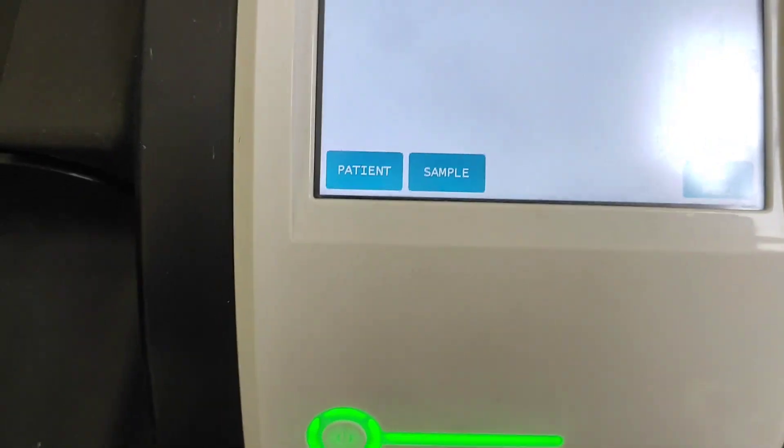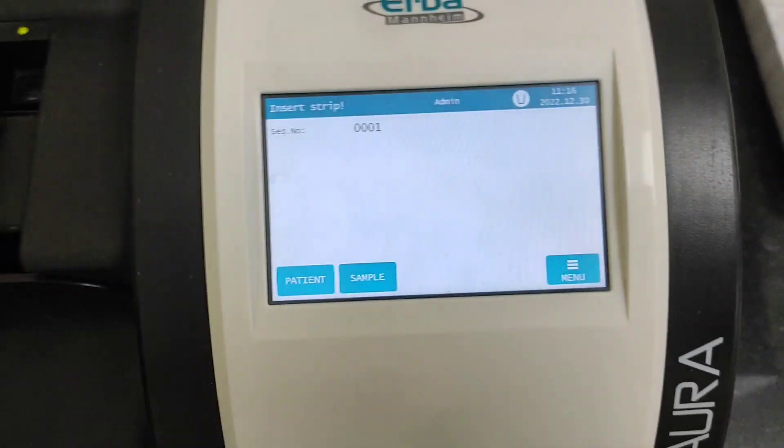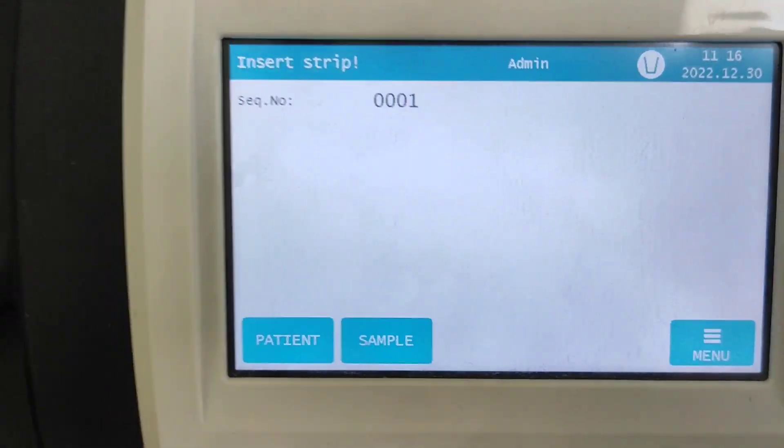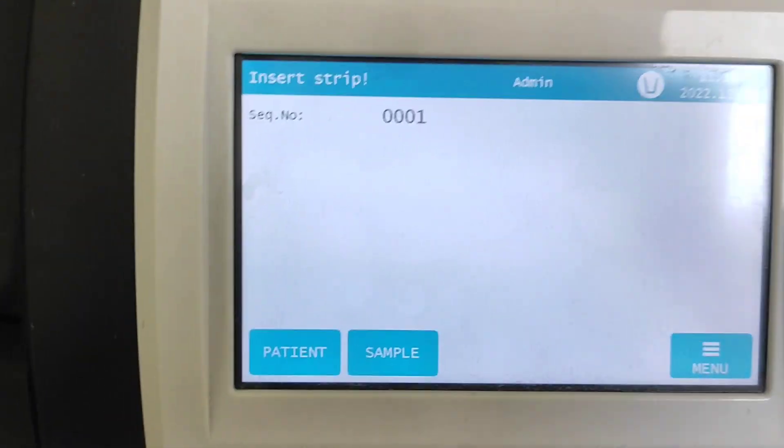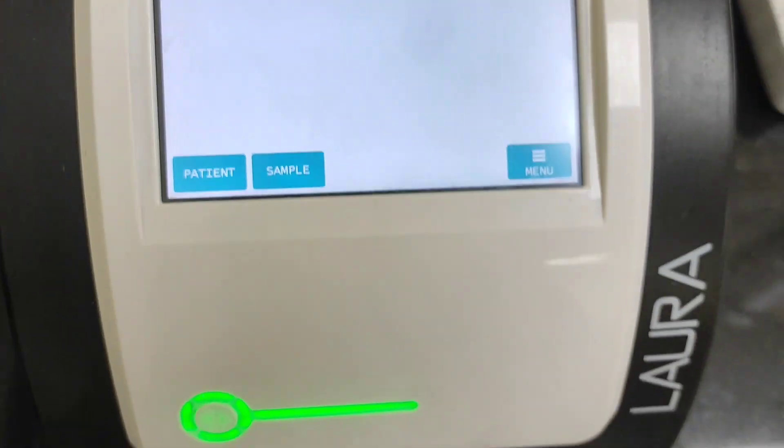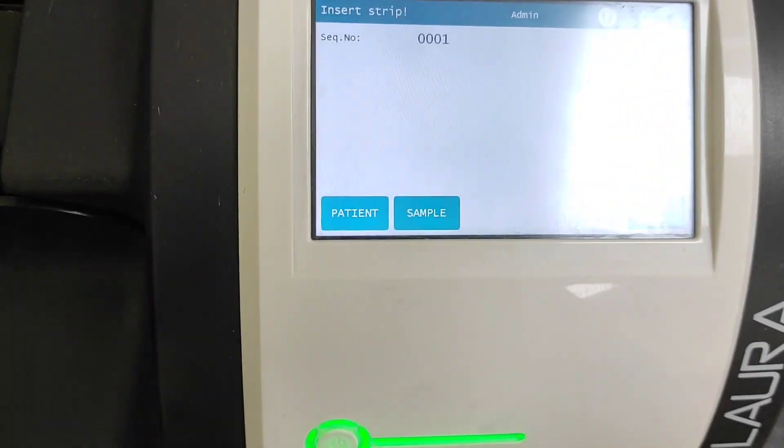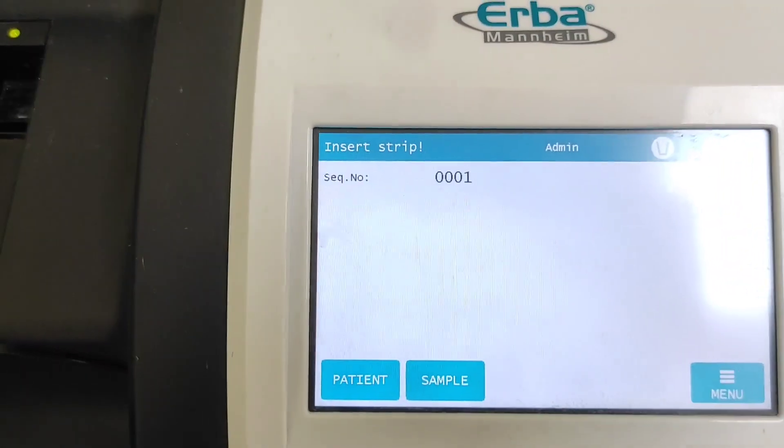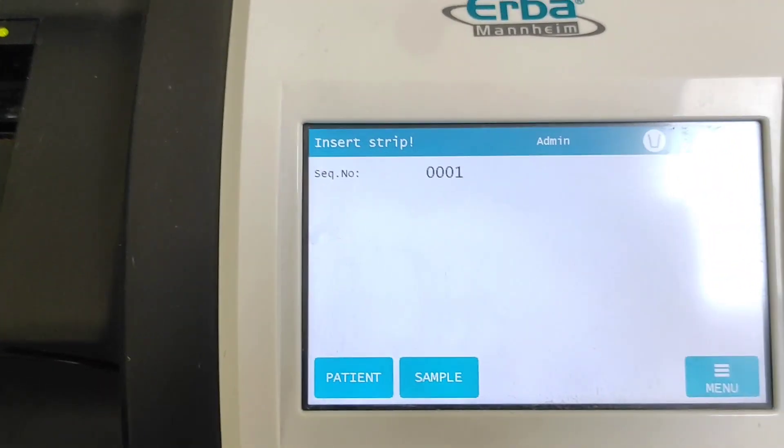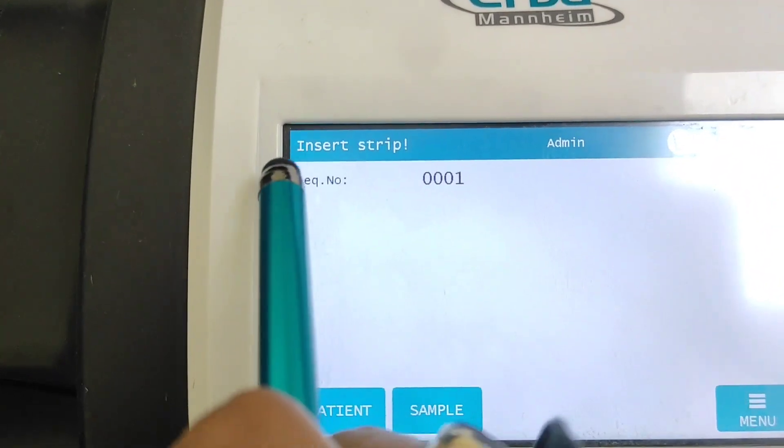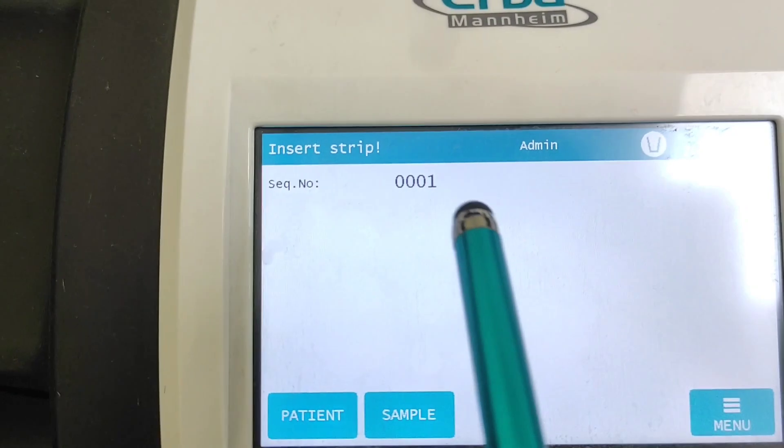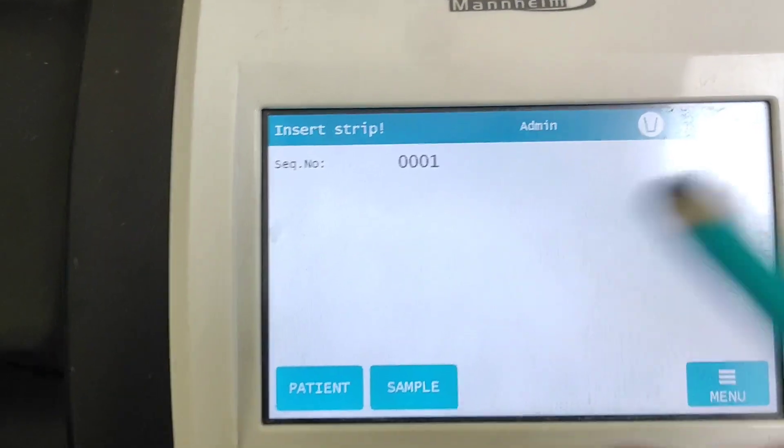So yeah that's it. And as you can see, if you are running the sample in the sequence, as you can see here is the sequence number 0001, it will just automatically change the sequence. And here is the time and date.